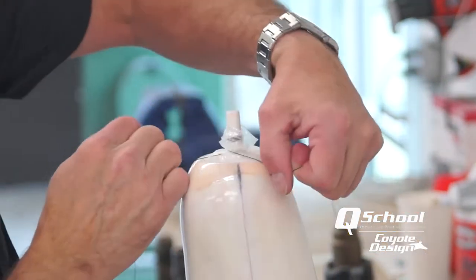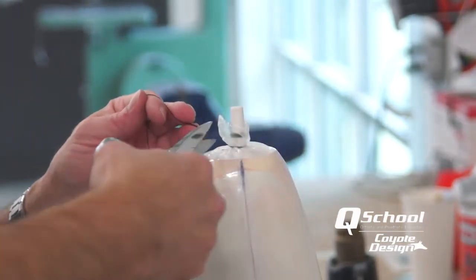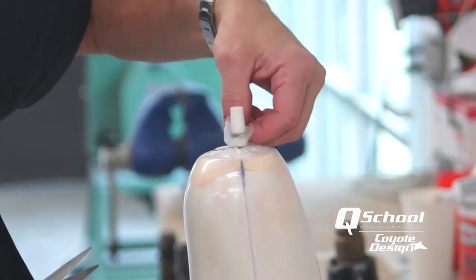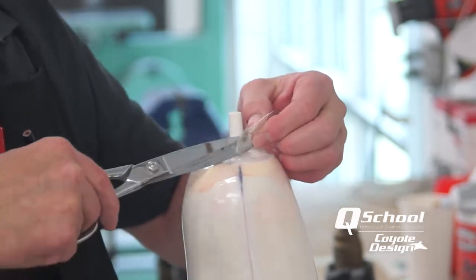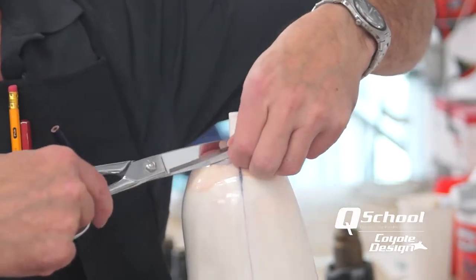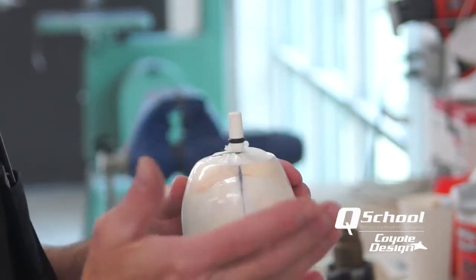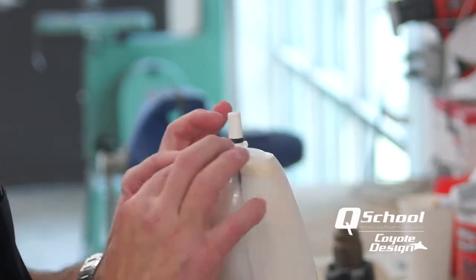Now we want to take our string and tie it in that same place — get that right in that groove. A couple of quick knots. We'll get rid of this flagging because that could interfere with our lock going on. Just run it up there close. Wrinkles inside of that ring — no big deal. Wrinkles out here — that's what you're going to see, and it's outside of the area of the lock.